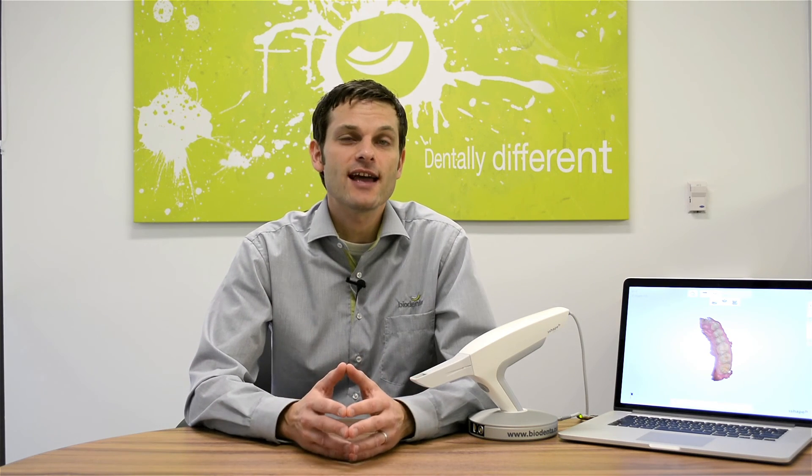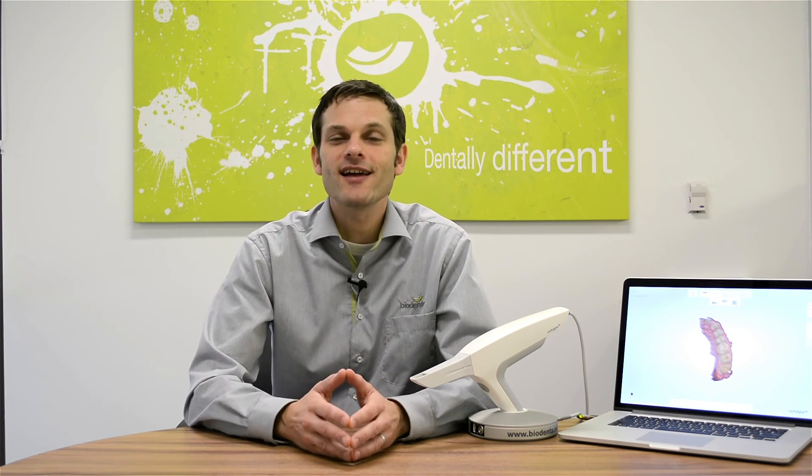DentaSwiss by 3Shape TRIOS represents a fast, accurate, and easy-to-use digital impression scanner for a wide range of clinical indications. With configuration options, powder-free scanning, and robust yet intuitive scanning software, it is designed to integrate seamlessly into almost any dental practice. It is open, efficient, flexible, and backed by the DentaSwiss commitment to support. So give it a try and see for yourself. Thank you for joining me. We are glad you've chosen to be dentally different.